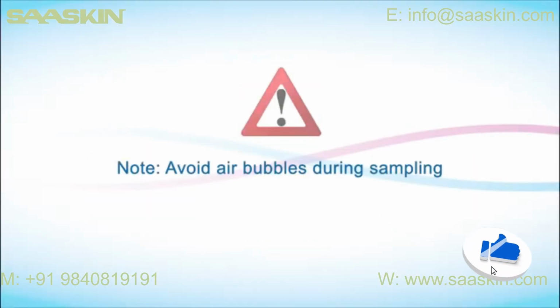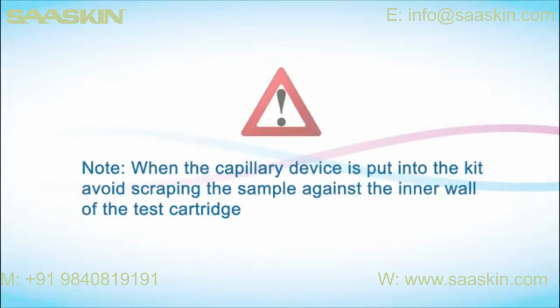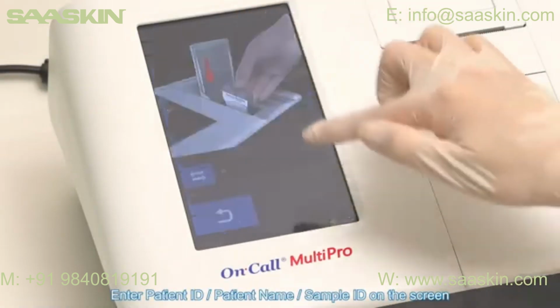Note: avoid air bubbles during sampling. Snap the filled capillary device into test cartridge. Note: when the capillary device is put into the kit, avoid scraping the sample against the inner wall of the test cartridge. Enter patient ID, patient name, sample ID on the screen.